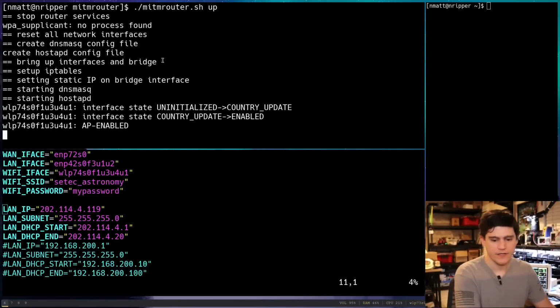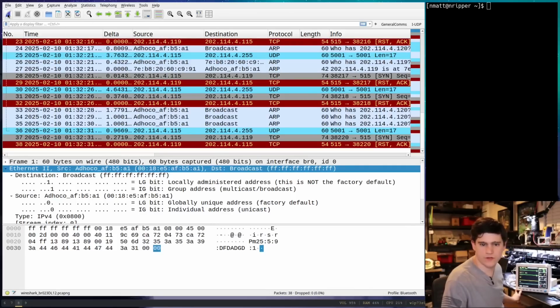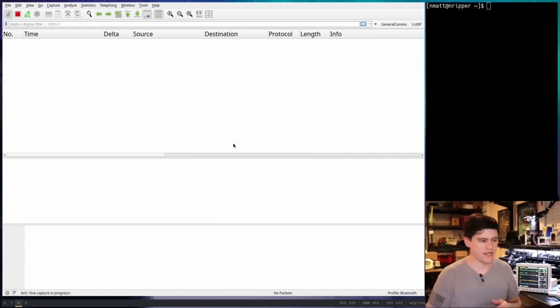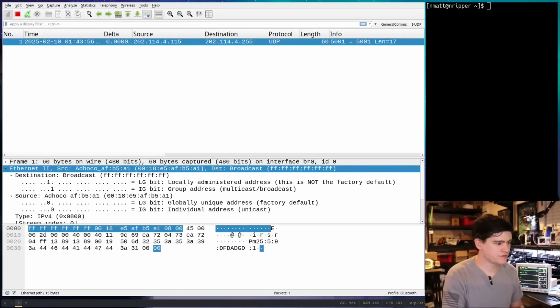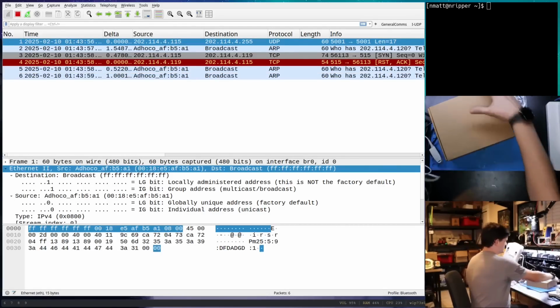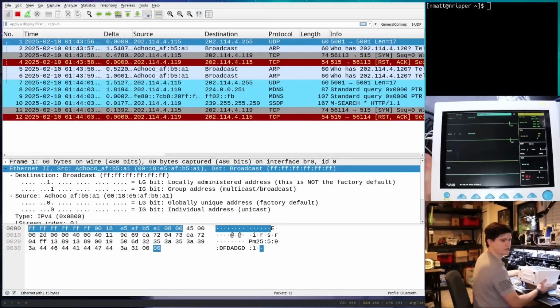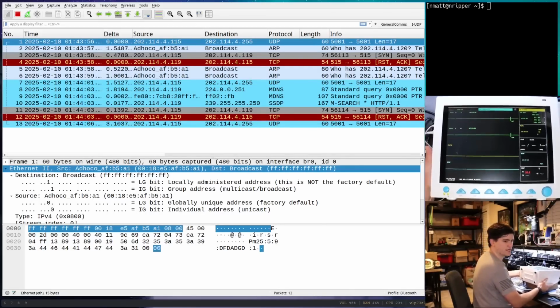running that here. And then if we come over to Wireshark, I'm getting packets, and we're going to watch what happens when we take a packet capture. We don't actually need to reboot the device today, but we are going to set up this fancy view so we can see everything that's going on, because this is going to be helpful when we start to decode data.